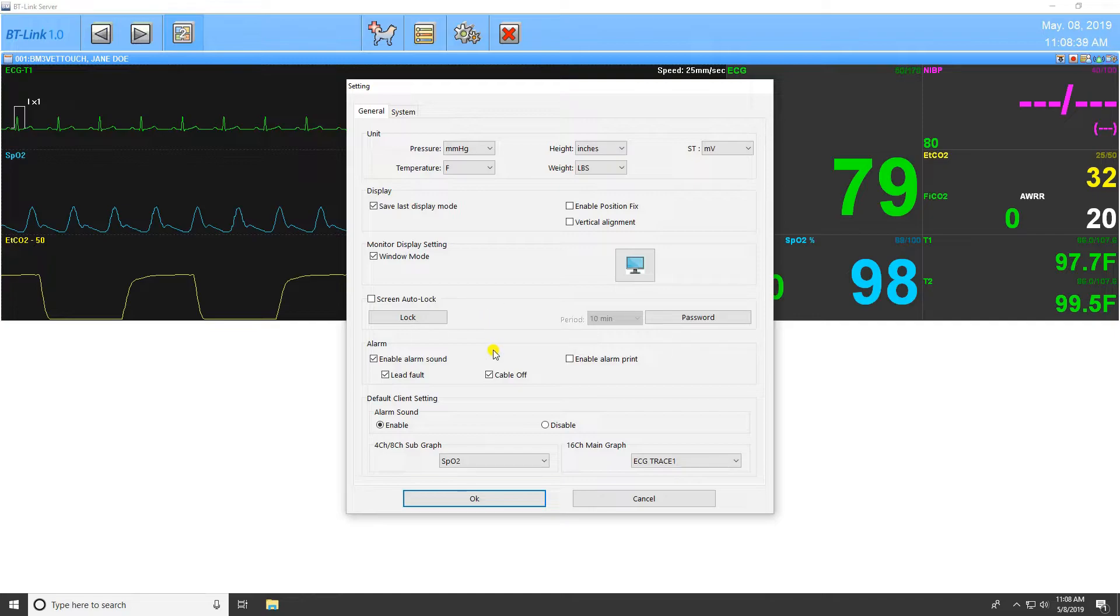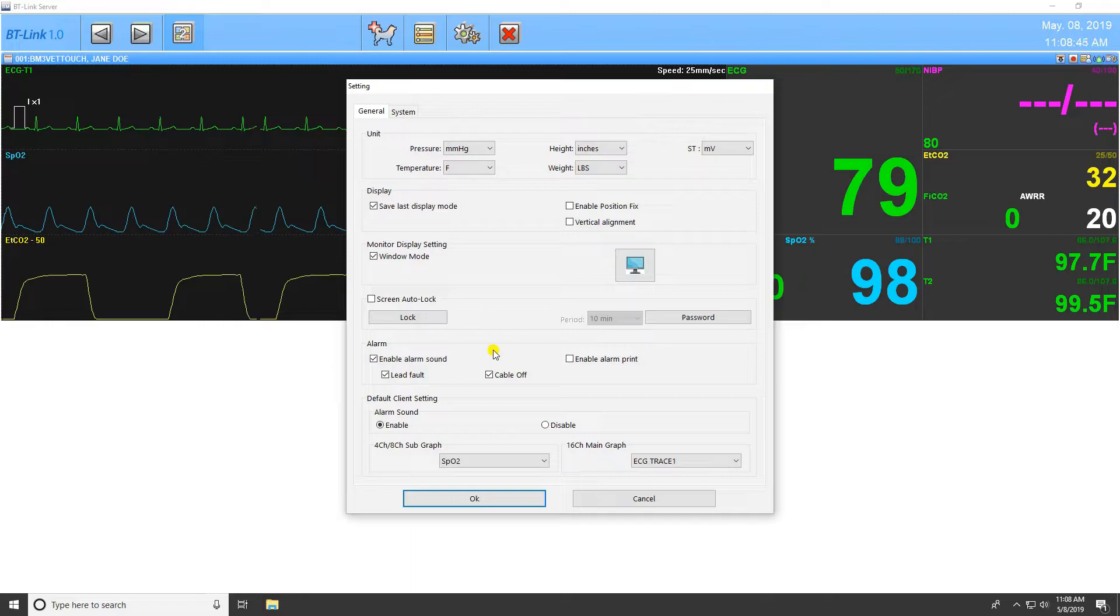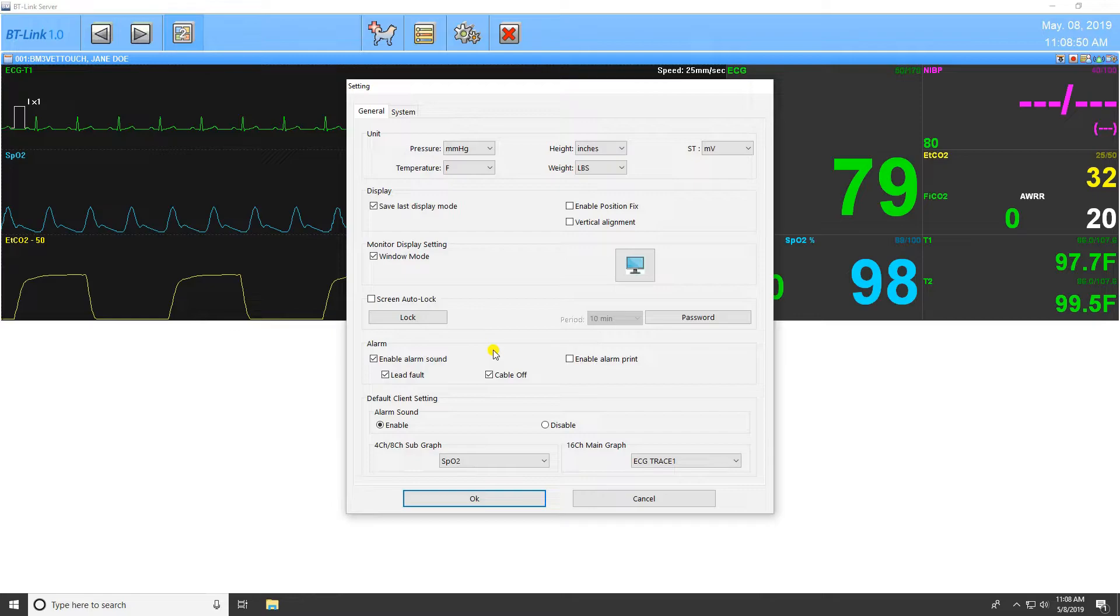The next setting is the Alarm setting. This allows you to change if alarms are enabled across the entire software and under what conditions alarms are triggered. Be advised, disabling alarms here will disable alarms entirely, even if they are enabled in the client window.